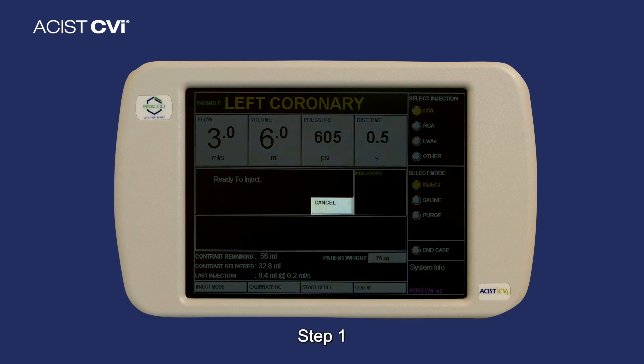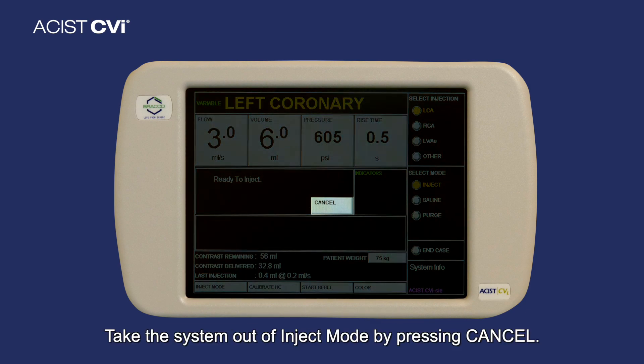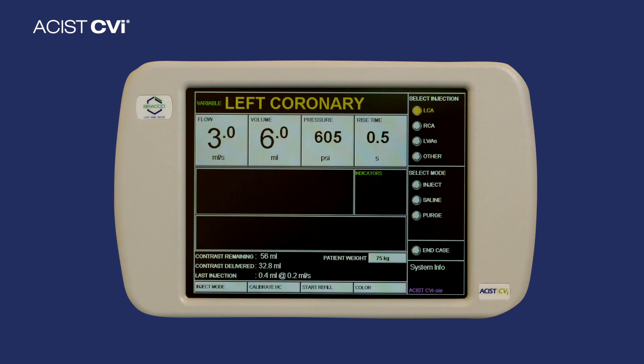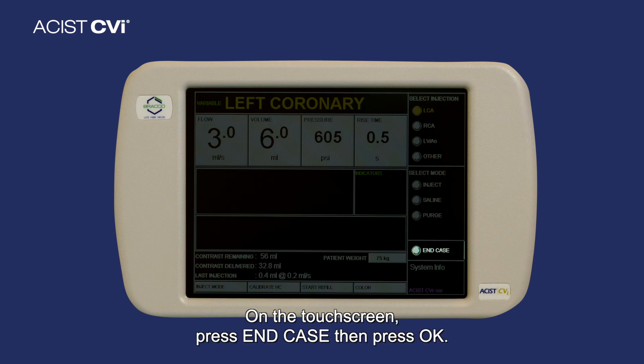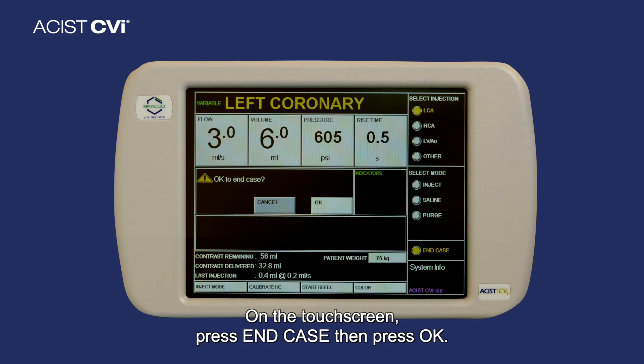Step one: take the system out of inject mode by pressing Cancel. Step two: on the touchscreen, press End Case, then press OK.